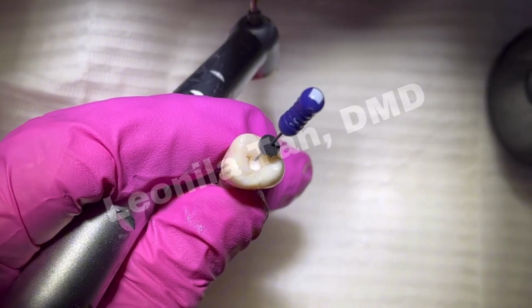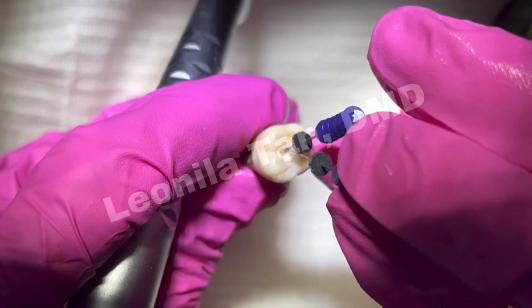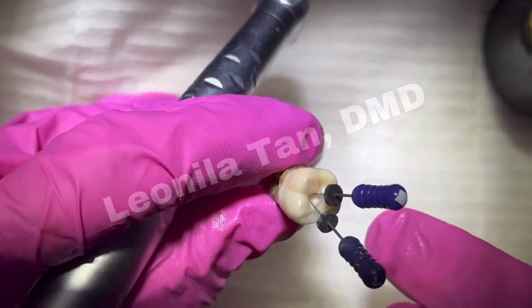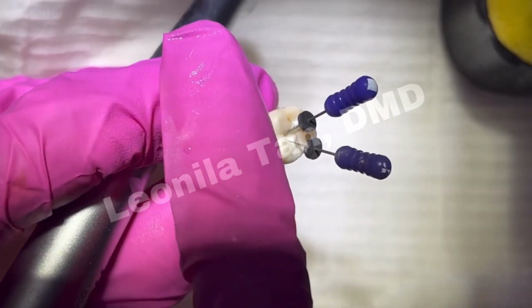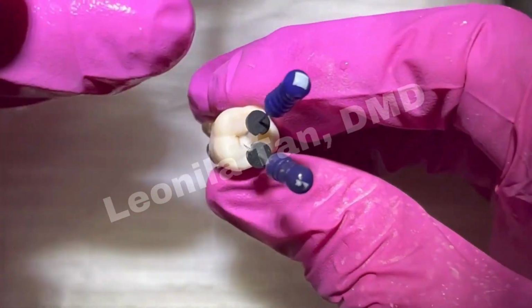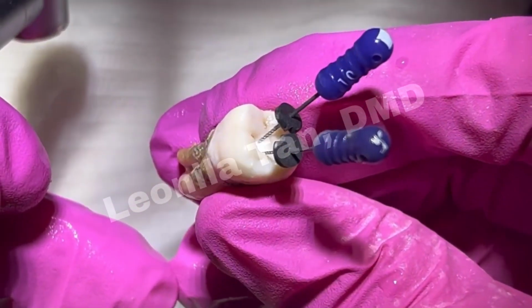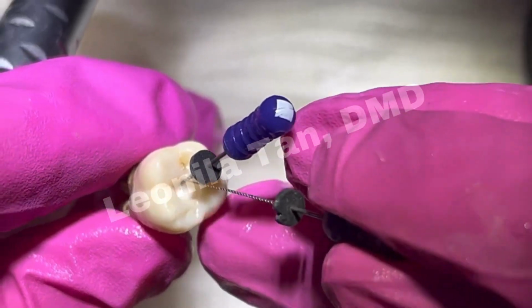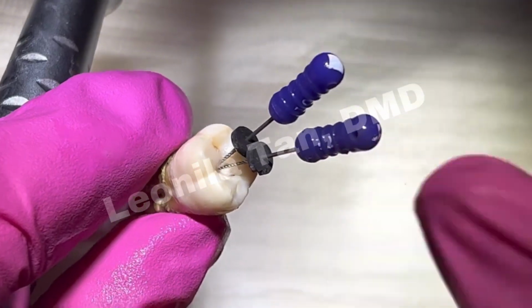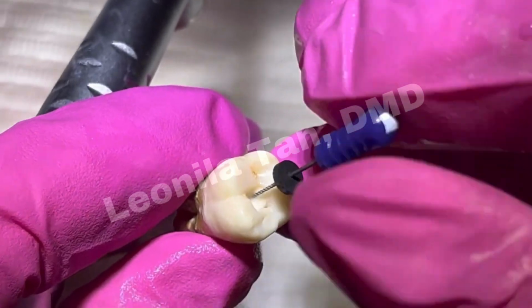So let's get another file and let's just see if they go in another direction. So notice you have two files, one going to the distobuccal area, and you have another file going to the mesiobuccal area. Because if it goes to the same hole, notice. Okay, so the direction of the file will tell you if you have located the other canal.